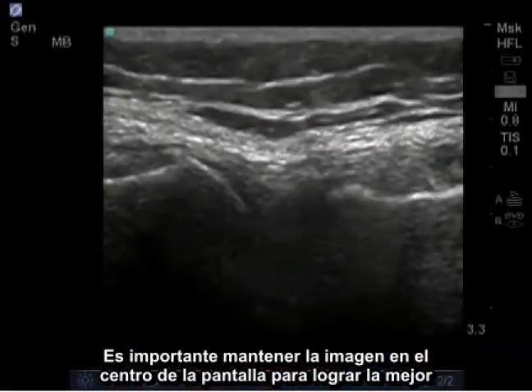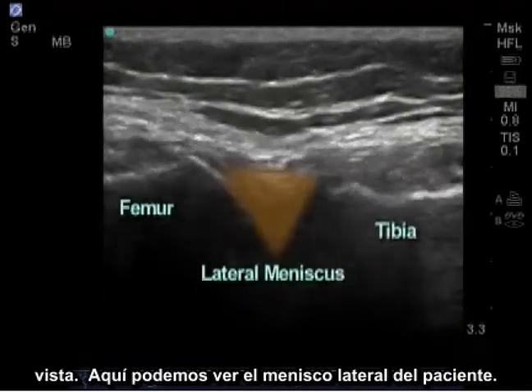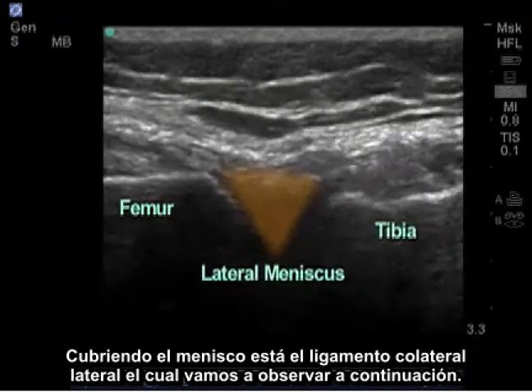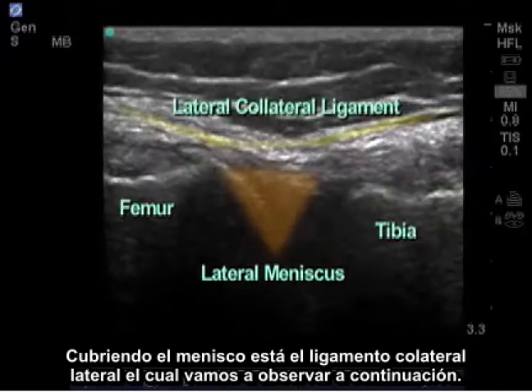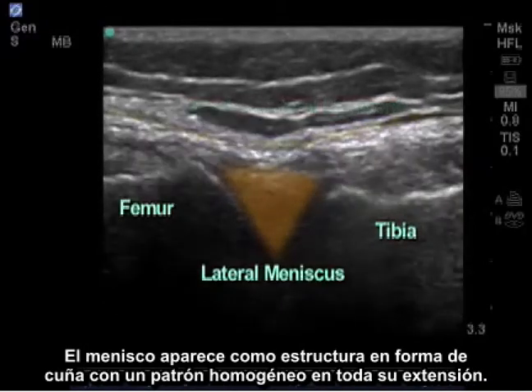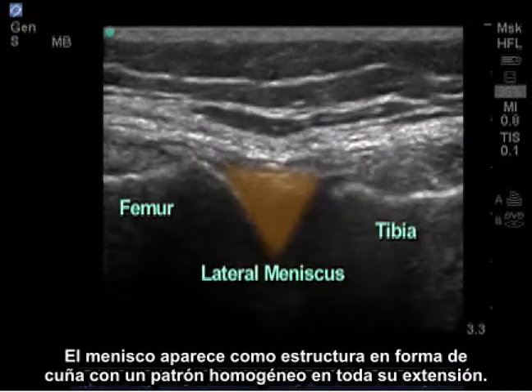It's important to keep your image at the center of the screen to get the best view. Here we can see the patient's lateral meniscus. Overlying the meniscus is the lateral collateral ligament, which we'll look at next. The meniscus appears as a wedge-shaped structure with a homogenous pattern throughout.